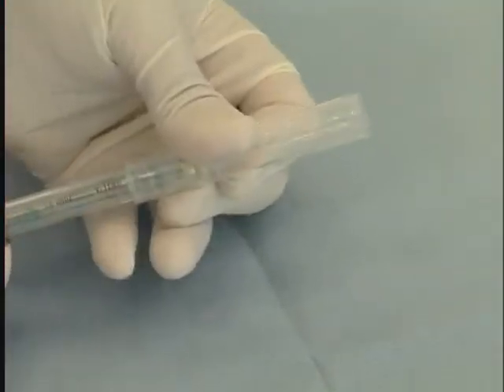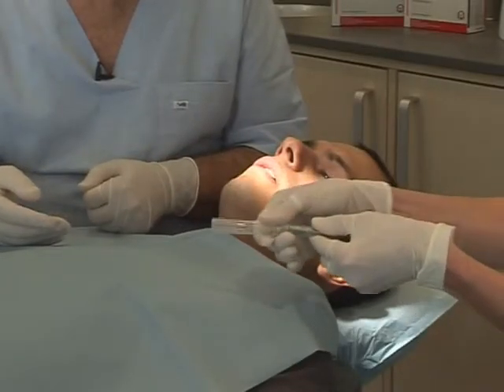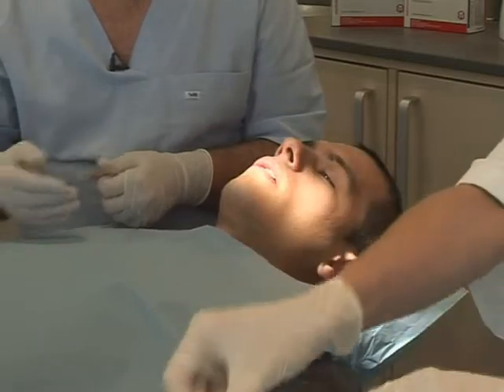The Safety Plus syringe that we are using in this clinical case is a safety injection device which is described in a separate chapter.